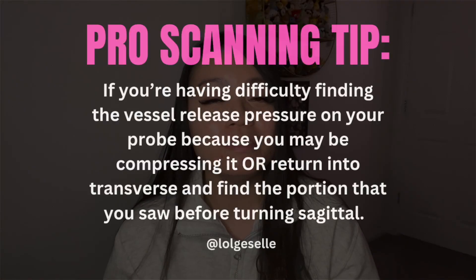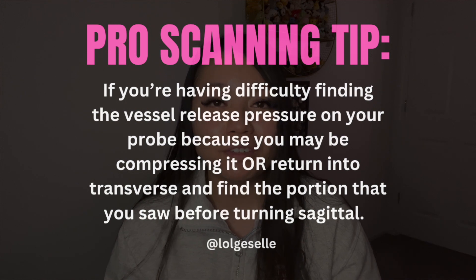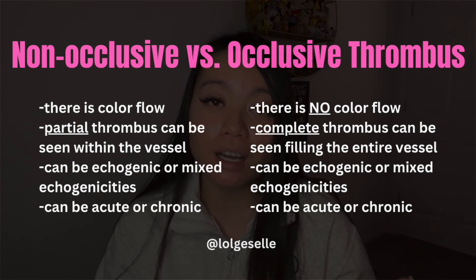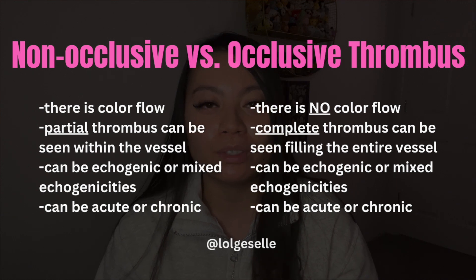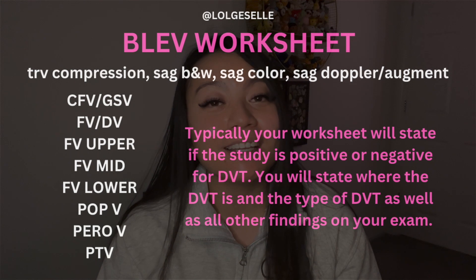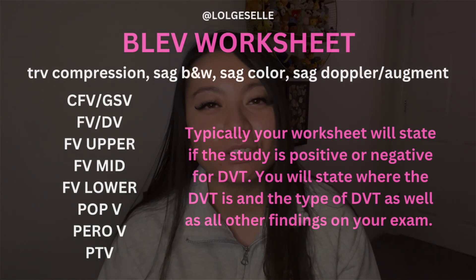I've found that doing leg vein ultrasound was really the first time I truly understood ultrasound, and it's one of my favorite exams because it's pretty straightforward — there's either a blood clot or there's not. Remember, there are two types: non-occlusive, where blood flow still goes through, and occlusive, where no blood flow goes through. With occlusive thrombus, you still want to do your color and Doppler to prove the occlusion, because after we do our ultrasounds we write our paperwork, and that documentation is what the doctors rely on.